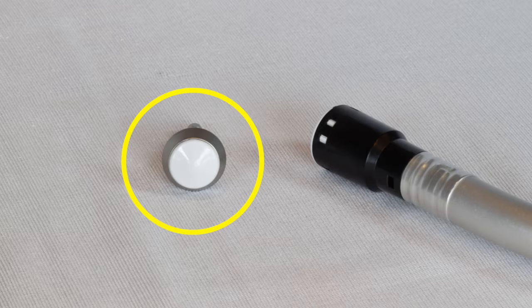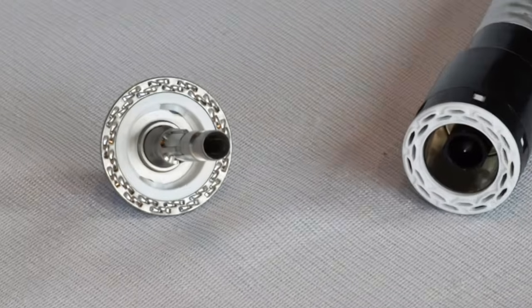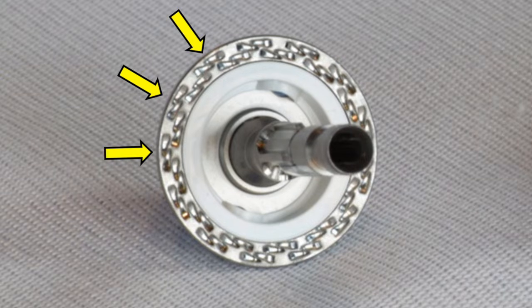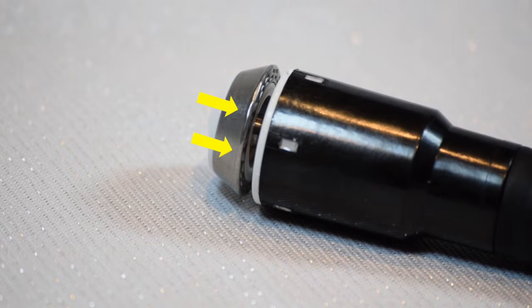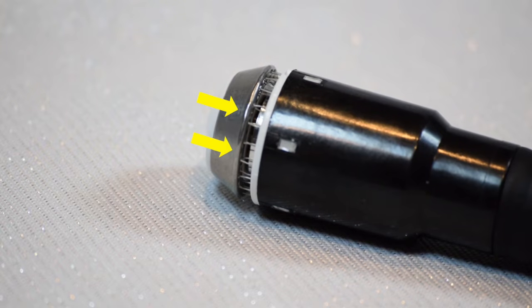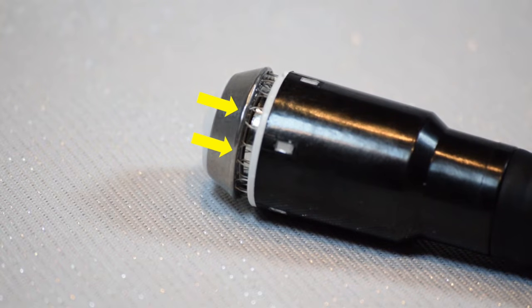Now here's what the anvil looks like, and again, this is the metal piece that the staples hit and bend to seal the tissue. Now I'm going to attach this and fire the stapler, and you're going to see these staples come out and bend. They don't bend very much because if I close the anvil all the way, you won't be able to see anything. But in reality, it's going to be closed more than this.